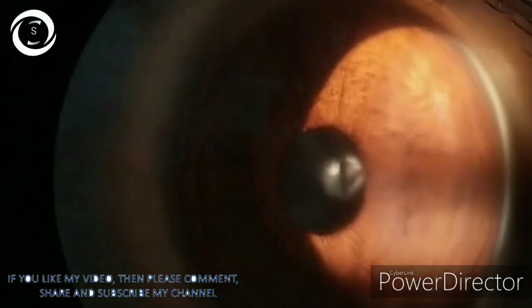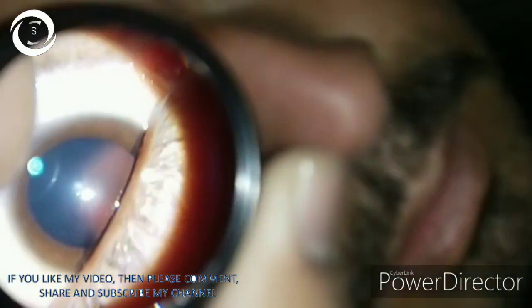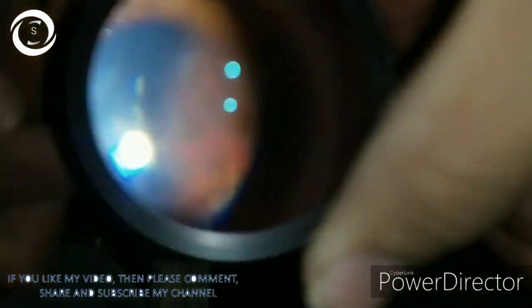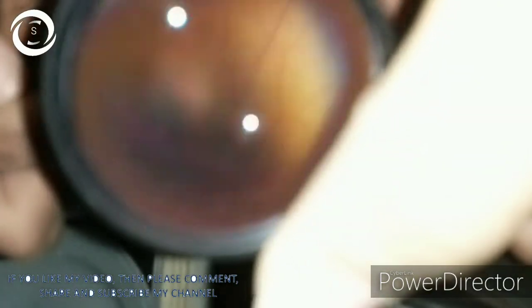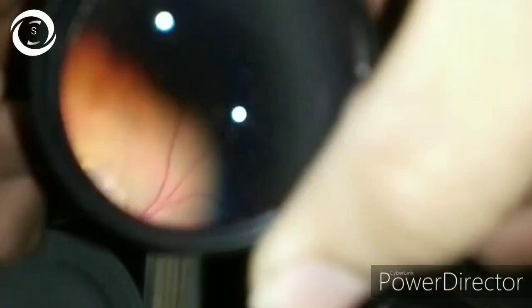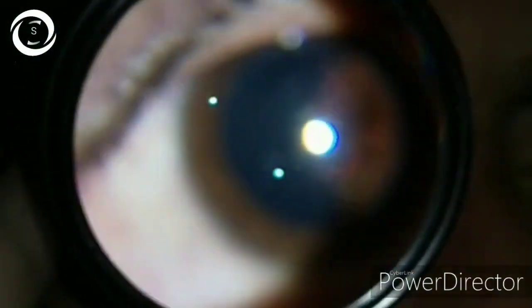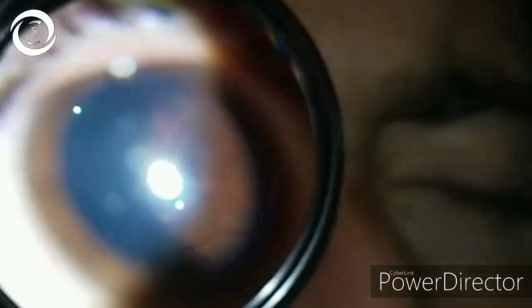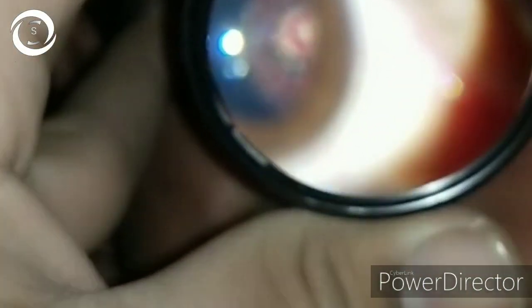In high myopes, examine the fundus thoroughly and rule out any pre-existing retinal degenerations, holes, or breaks, and address that issue beforehand. Do B-scan to rule out posterior staphylomas. Do IOL calculations by IOL Master or any form of optical biometry, which is more accurate than ultrasonic. Look at the tilted disc, myopic crescent, and chorioretinal atrophy in this patient. You should explain the procedure very well, including its complications, before or after retinal laser.